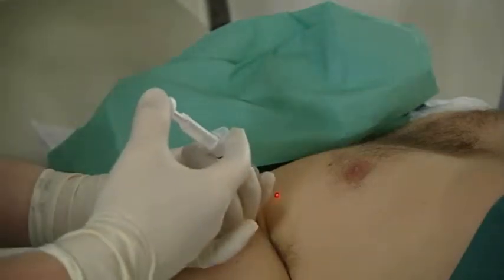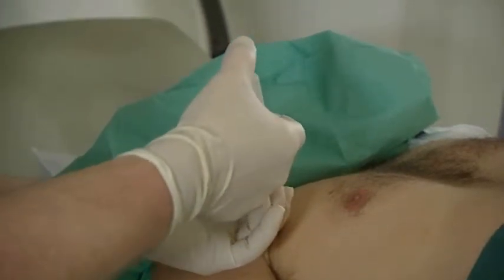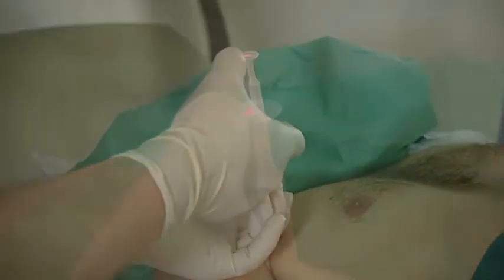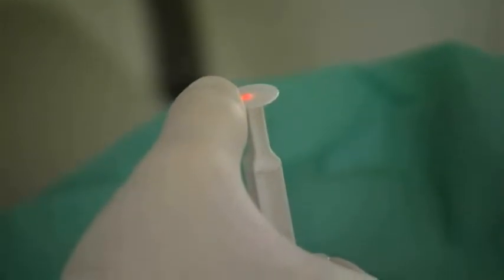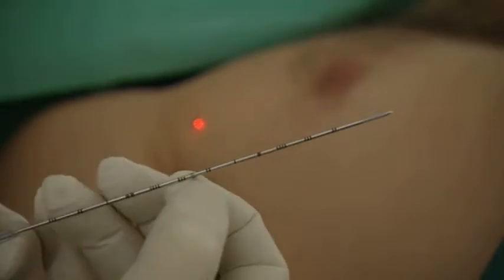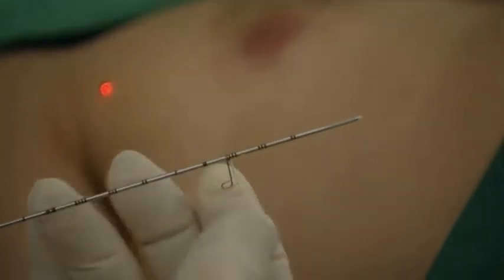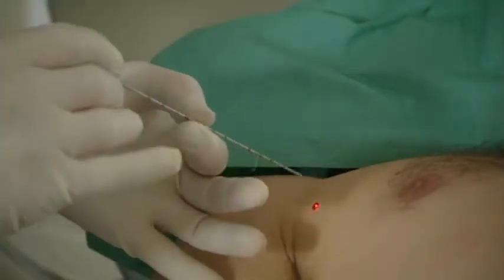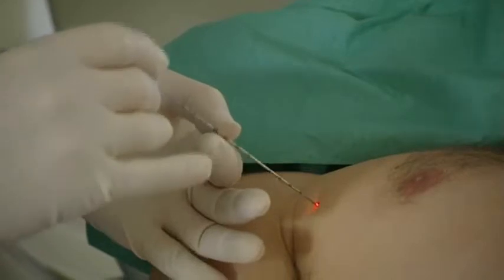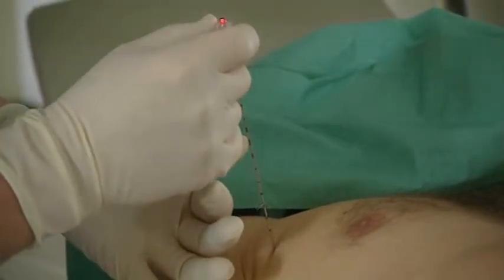Using the SimpliCT when applying anesthesia, one can precisely anesthetize the puncture tract. After marking the depth of the needle, the introducer needle should be slightly entered into the subcutaneous tissue before the needle hub is raised to align it with the laser light. Alignment is obtained when the needle hub is illuminated by the laser dot.